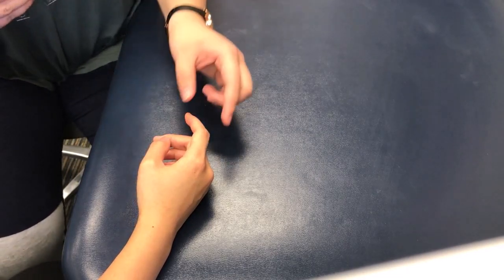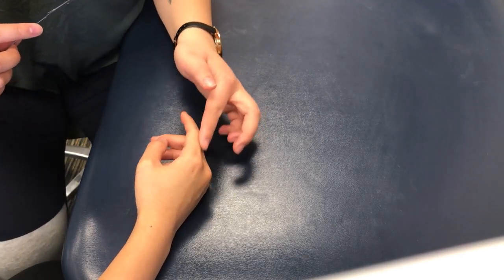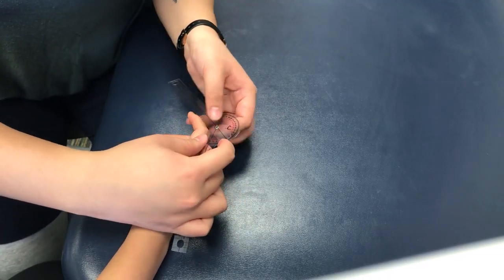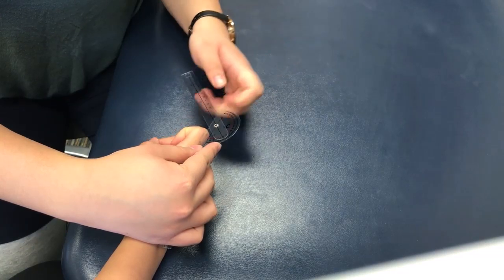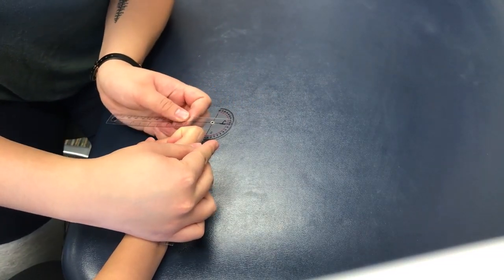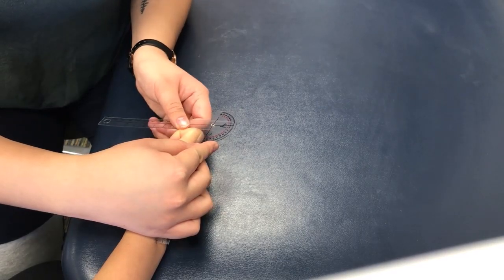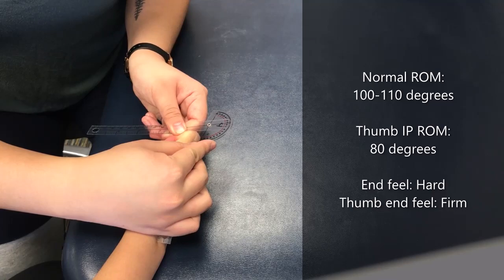For PIP flexion, the axis will go on the dorsal side of the PIP joint, and the proximal arm will be on the dorsal side of the proximal phalanx. And then the distal arm will be along the middle phalanx. So go ahead and curl your finger like this. So for active range of motion, I'm getting 100, and for passive range of motion, you'll push in end range. I got to 106.